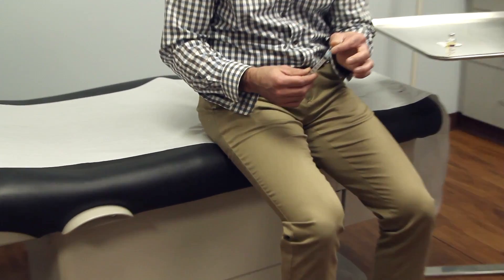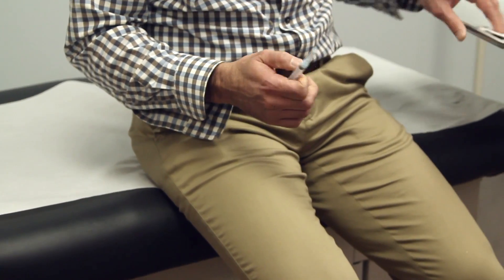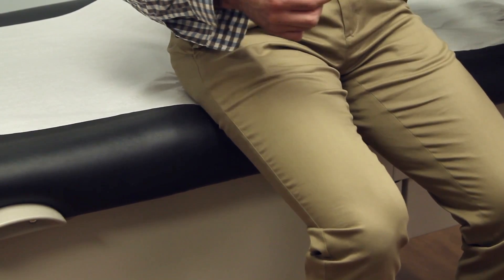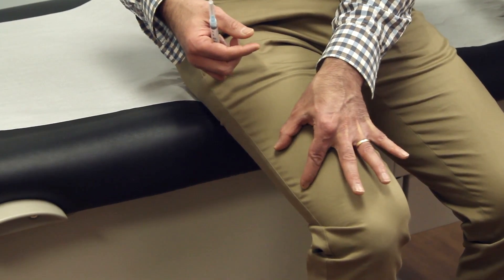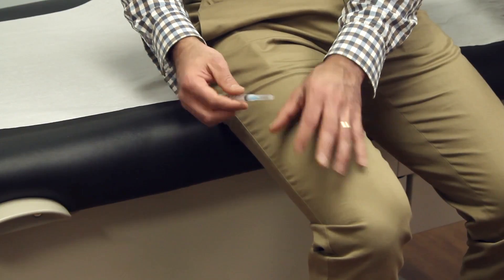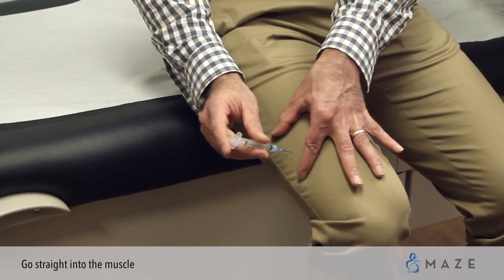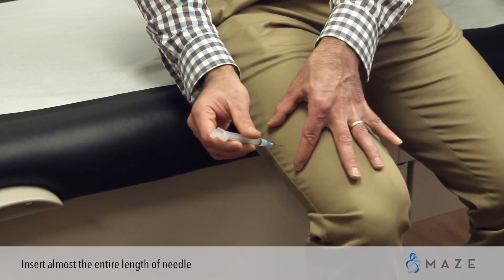To do an injection you will draw up your medication into the syringe. You will grab an alcohol swab and cleanse the area. With your non-dominant hand you will spread the skin apart to remove any subcutaneous or fat tissue. Once spread, take the needle and go straight in to the muscle — you will typically go almost the whole entire length of the needle.